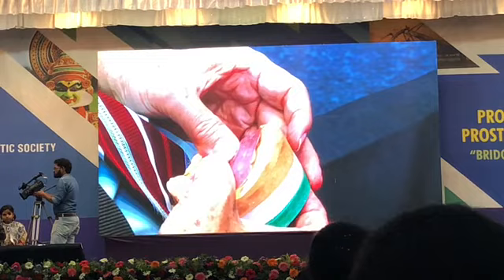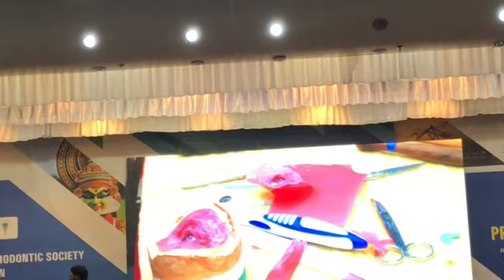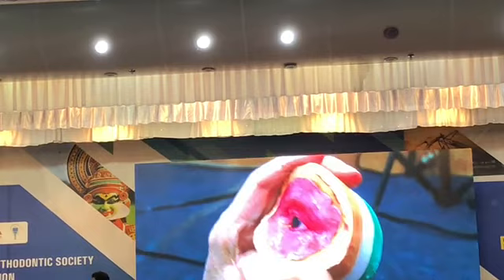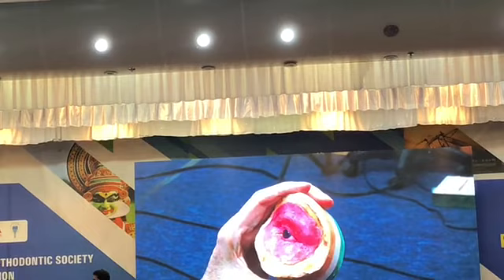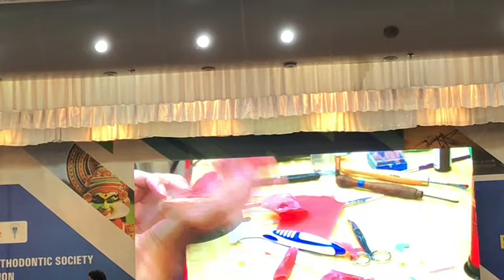Well, I really can't get the wax warm enough. But that's how you would do it in the clinic. You would stick it in a water bath for 30 seconds or a minute, and then that will evenly heat the wax. And then you can carefully rotate a little bit. As this one, the globe wasn't quite right. And so by moving it this way, you'll have more scleral show.